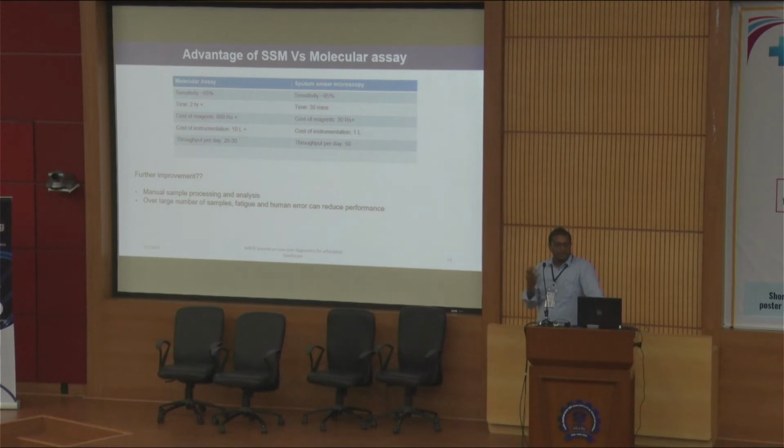Right now we have many molecular assay tests being used for TB diagnostics. And if you have to detect about 10 million TB patients, you need to test many more than that. So you have to look at the health economics. If we are looking at that many molecular assay tests, the cost burden is going to be very, very high.